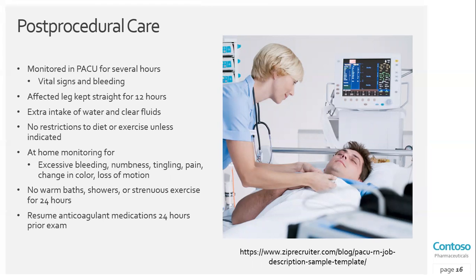They will then be encouraged to drink water and clear fluids to flush the contrast dye out of their system. Once they are ready to be discharged, someone other than the patient must be ready to drive them home. It is recommended that the patient not drive for 24 hours post-exam. Once discharged, there's no restriction to the patient's diet or exercise unless informed by the physician, and they should simply avoid strenuous exercise on the affected leg.